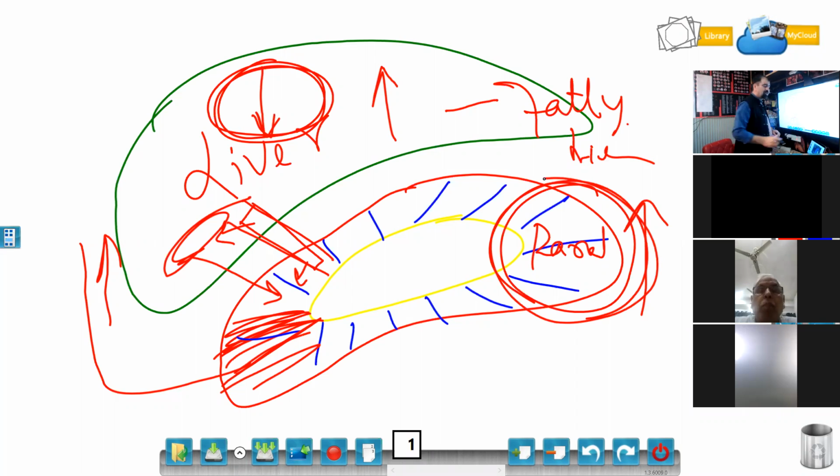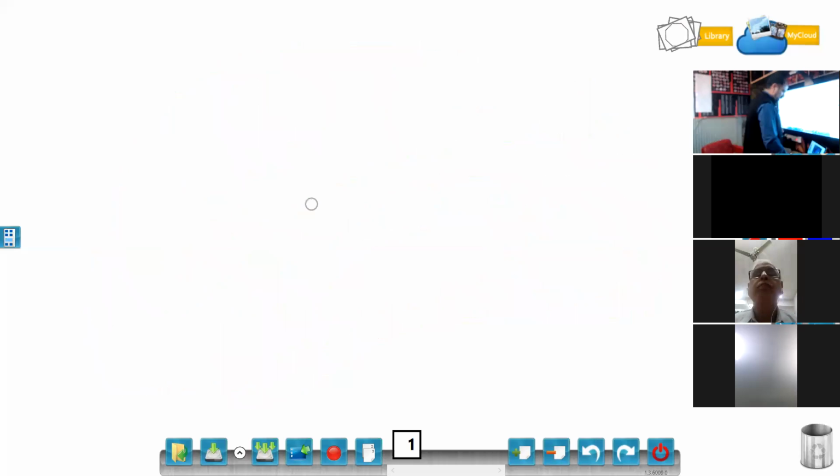Actually, the parenchyma is not increased, so don't unnecessarily overdiagnose a renal parenchymal disease. All this is possible when I know where the parenchyma is, what the components of the parenchyma are, and with what I have to compare the echogenicity.